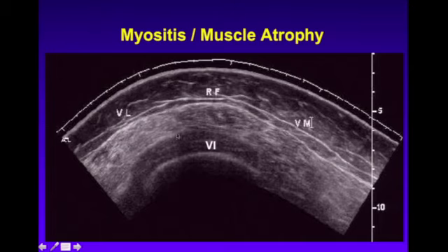And so you can see that compared to the other muscles, the vastus lateralis is much brighter, and it's lost the normal pennate pattern that we associate with the normal muscle. So that was the muscle that we chose to have the surgeon biopsy. We can also do percutaneous biopsies, but usually for neuromuscular disease, it's nice to have a large piece of tissue to be able to properly diagnose it. So we can't specifically say what kind of abnormality this is, but what we can say is biopsy the vastus lateralis muscle because it's the most abnormal appearance.